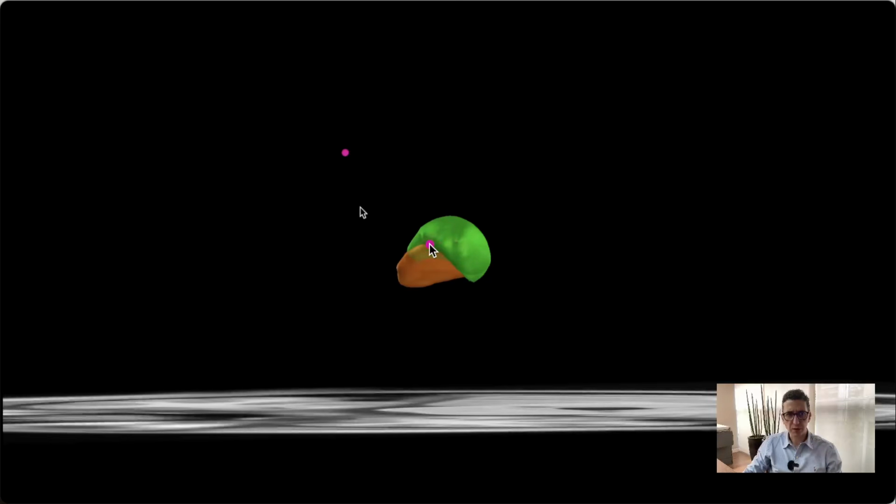But the most important is that when you look at here, we are going to see this kind of area in the STN where you are going to probably see the most important motor benefit. And this is important because when you go to the tablet in the next class, you're going to see that I cut the STN in this way. I'm going to teach you.